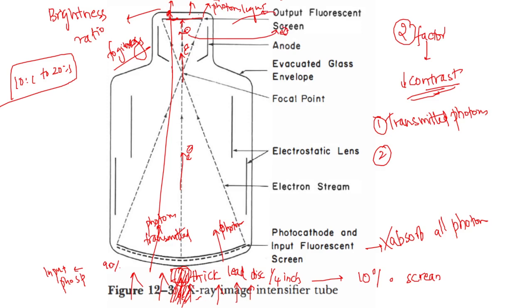Sometimes the light, instead of flowing in the forward direction, flows in the reverse direction. This is called retrograde flow of light. There is an aluminium protector which prevents the retrograde flow of light, but sometimes it may allow photons to pass.